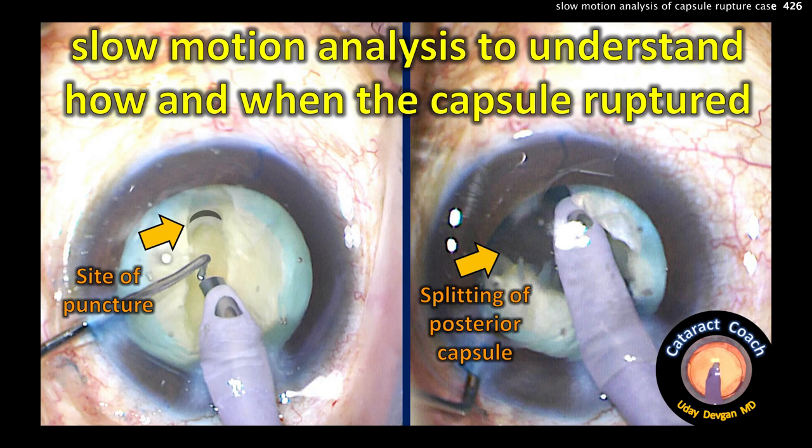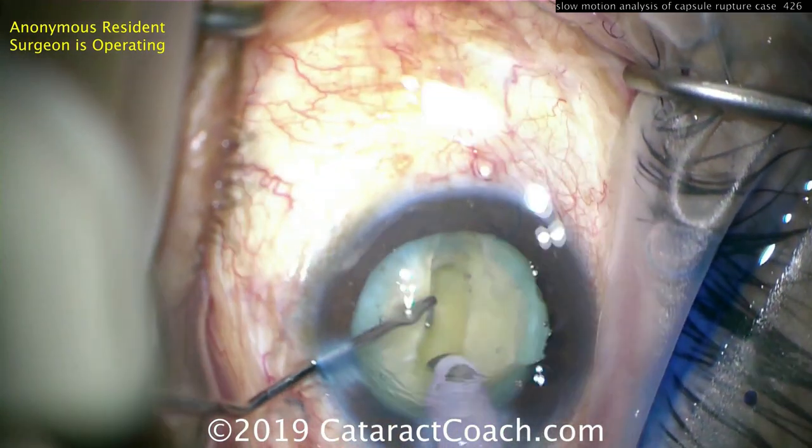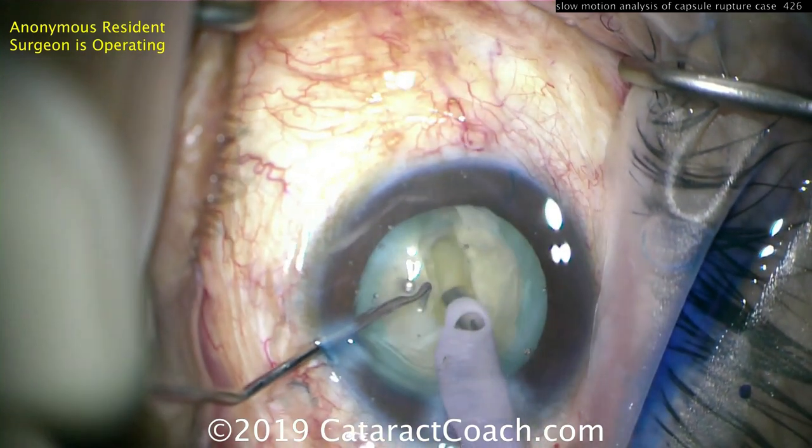CataractCoach.com: slow-motion analysis to understand how and when the capsule ruptured. I've seen this case before — I want to show you again in regular speed and then in slow motion.